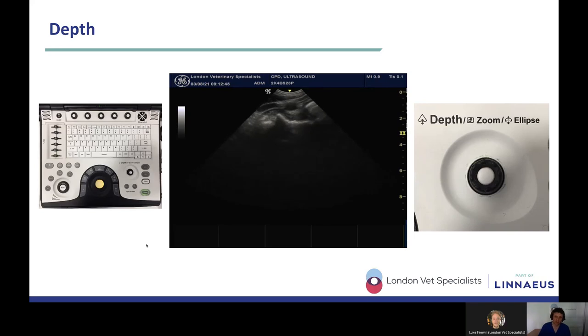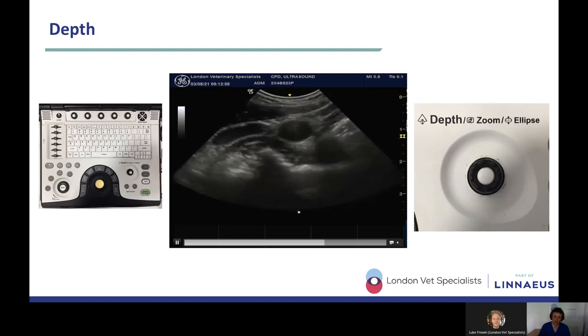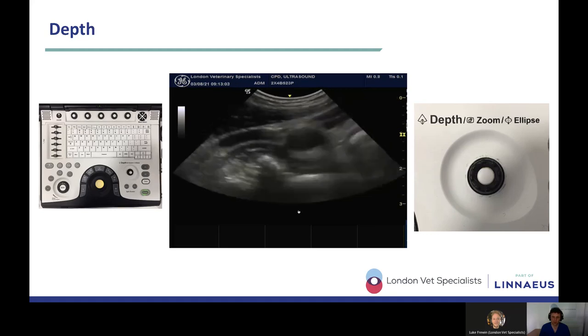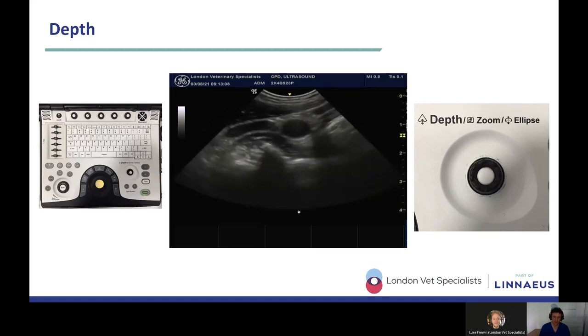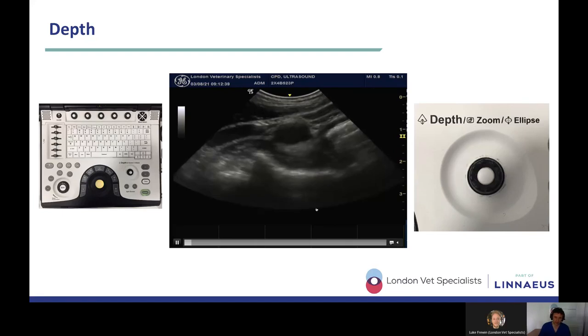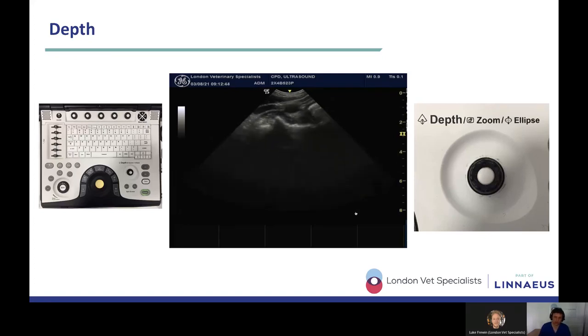You guys can see that that vessel, which I think is my pulsing common carotid artery, has disappeared off into the distance. And we're now at 10 centimeters, 8 centimeters, 6 centimeters of depth, right the way back down to 3, and then we can reduce that depth still further and make it 2 centimeters. So what you don't want to be doing is trying to examine a structure with too much depth selected. I mean, this would be really suboptimal.